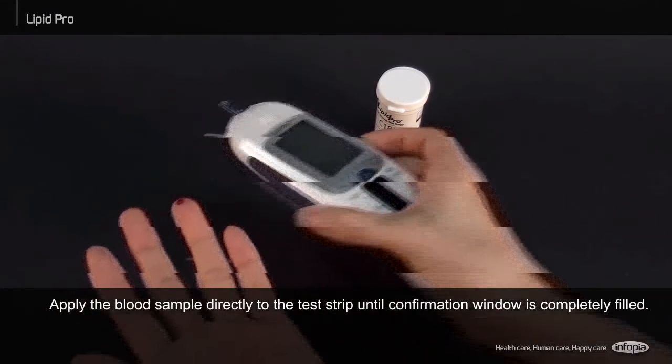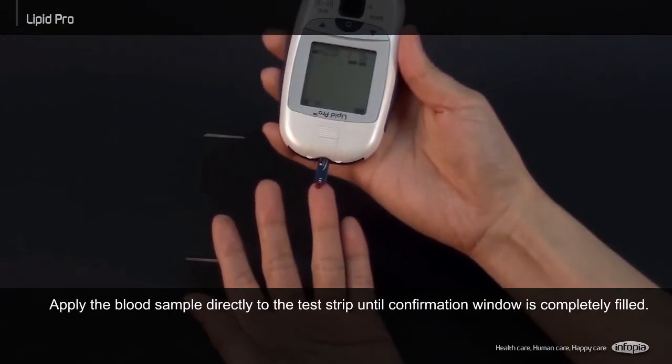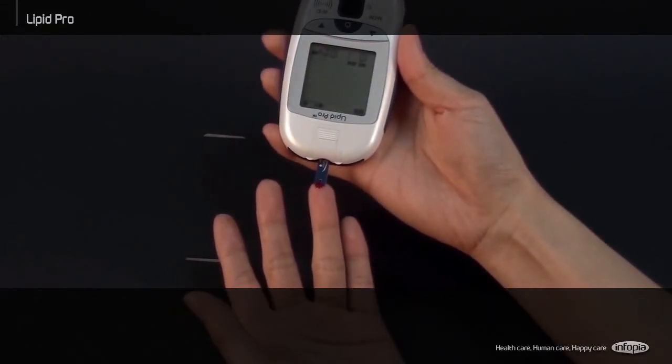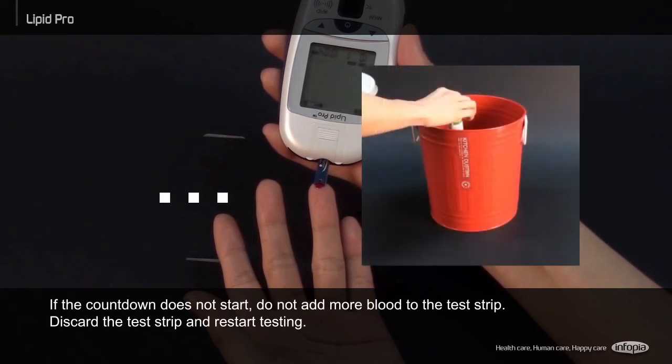Apply the blood sample directly to the test strip until the confirmation window is completely filled. If the countdown does not start, do not add more blood to the test strip. Discard the test strip and restart testing.